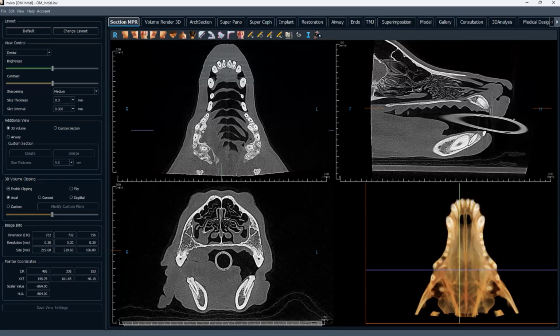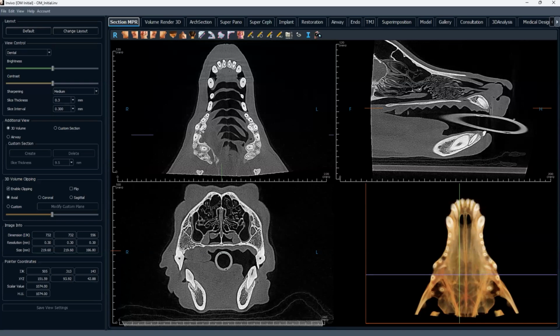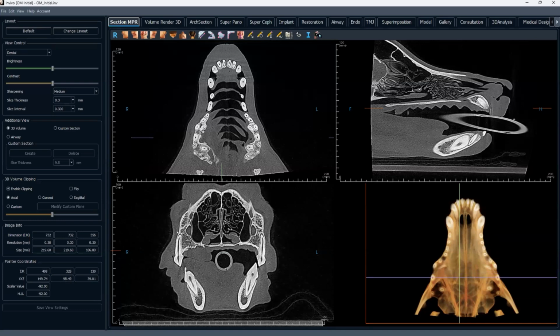If we go ventral to the infraorbital, then we might end up cutting through the tooth roots and then having to extract them. And then we might leave part of the alveolus behind, which could theoretically have tumor cells in the ligament. If the tumor does that, we don't know much about this tumor. Maybe it could do that. If I get the whole alveolus, I feel pretty confident that we have a full layer of bone between this tumor. And if I can do that and still leave the infraorbital, then we keep the blood supply, we keep the nerve supply. We don't mess with the nasolacrimal duct, and it's a less invasive surgery. But basically, we have to thread the needle.